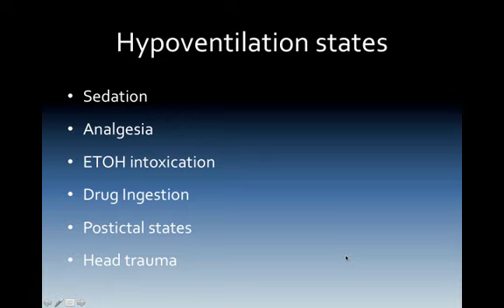Hypoventilation states, things like sedation, analgesia, conscious sedation, increase end-tidal CO2. We should watch for the need to intubate the patient or oxygenate the patient. In analgesia, same way, and this would be both in sedation and analgesia, if we get increasing CO2s, we may need to increase their stimulation, either assist their ventilations or put them on oxygen.